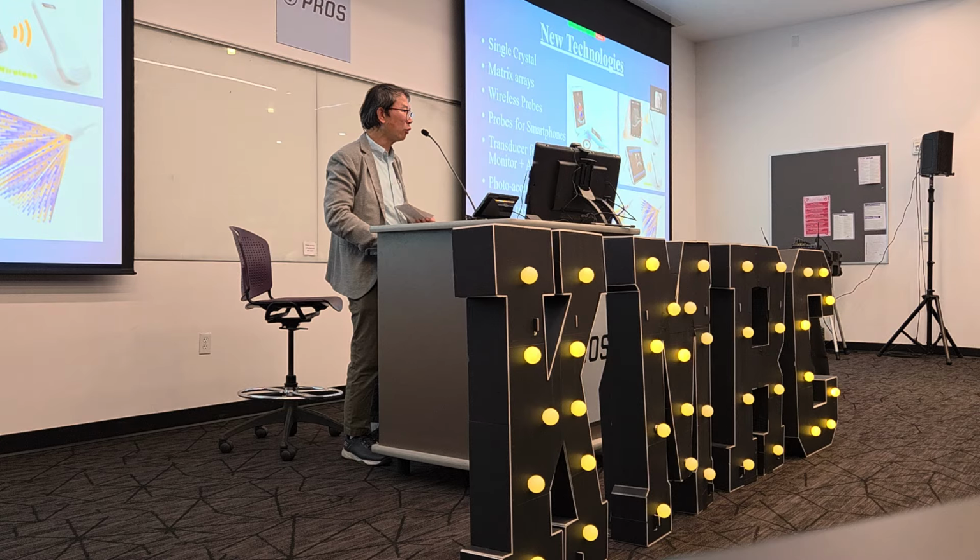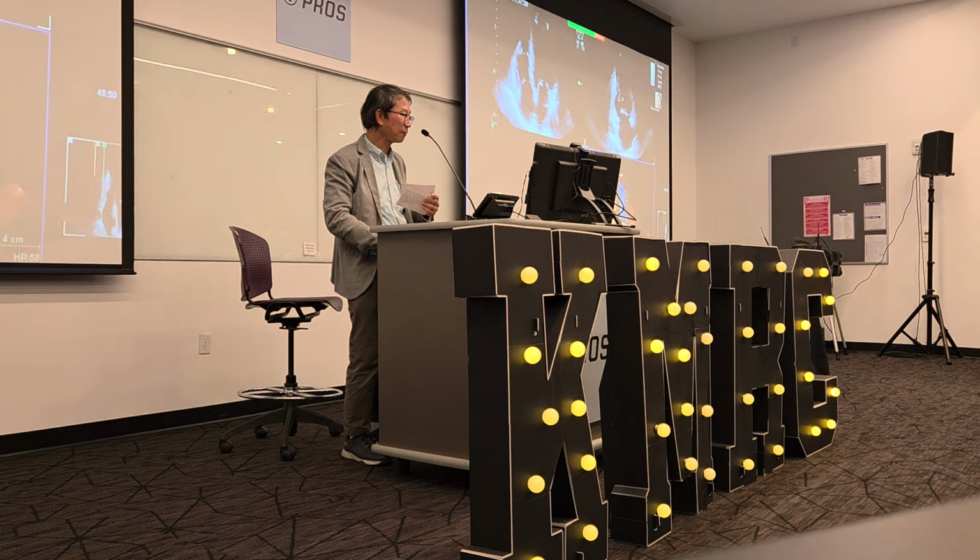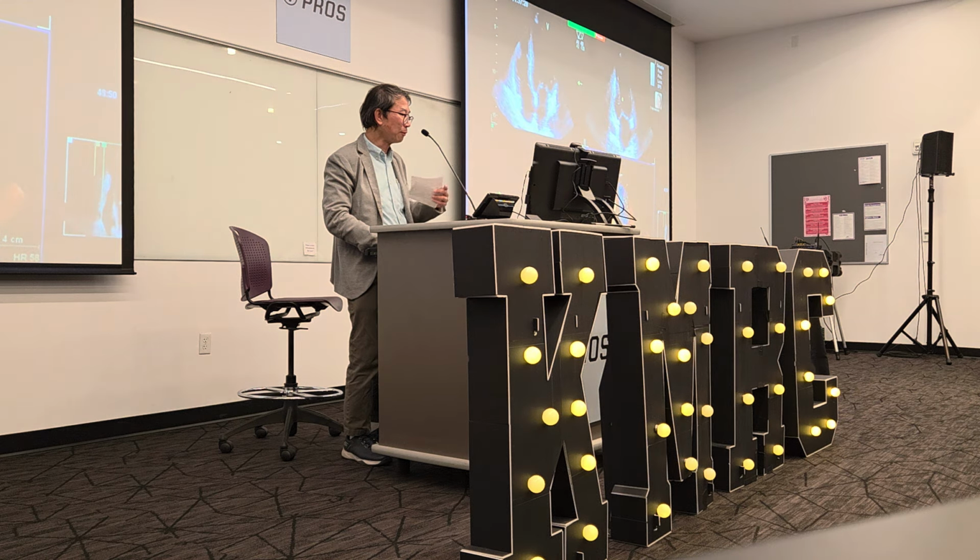Okay, so the new technology not only has a wireless probe, so you can hold it in your hand and send the image to your cell phone, but also image fusion, whether using MRI or ultrasound. And the one I also mentioned, the patient monitor. This is some of the amazing technology to demonstrate you can see the heart in real time and in 3 dimensions.